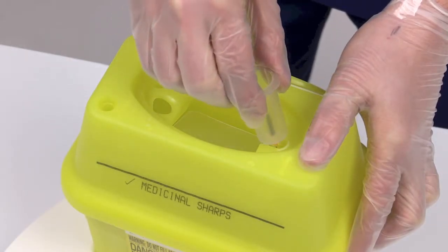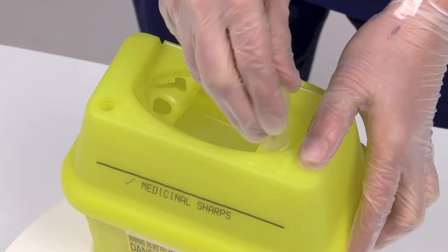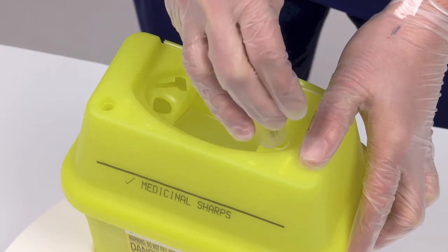With the container held firmly, rotate the syringe anti-clockwise until the needle unscrews from the syringe. Allow the needle to drop into the SharpSafe container.